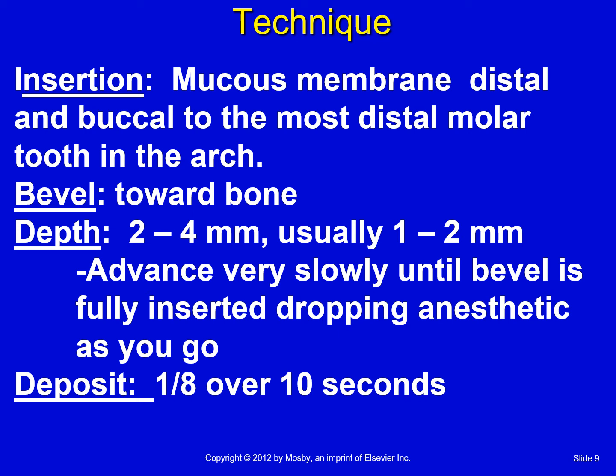The depth is anywhere. You could hit it just very quickly, or it could be up to 4 millimeters. So it's somewhere between like 2 and 4 millimeters. Usually it's only 1 or 2. Millimeters are pretty small, so that needle goes in very often. It just connects like boom right away.